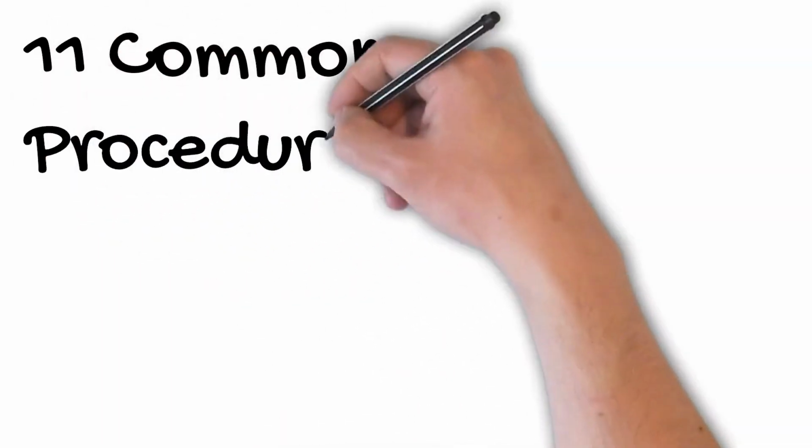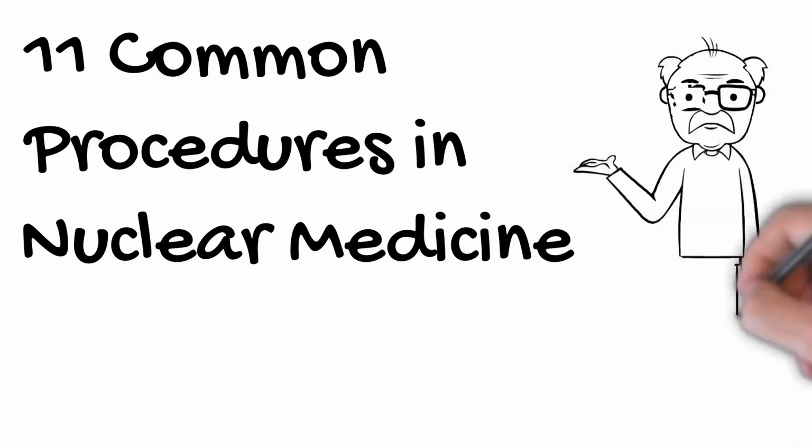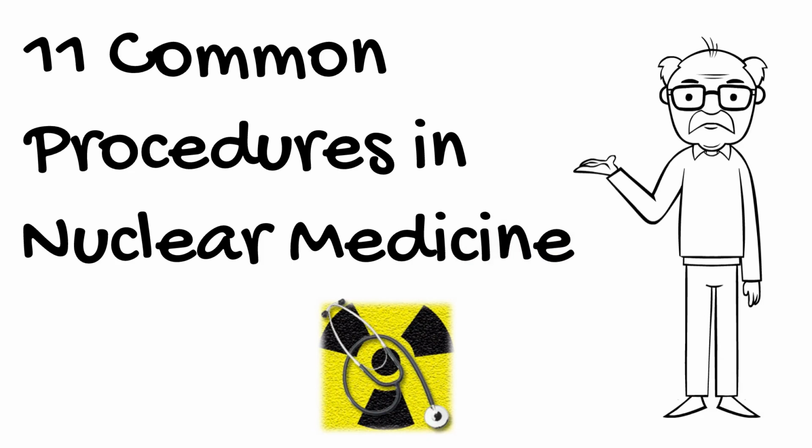If you've watched some of the other explainers in this series, you may be curious to see what kind of procedures are performed in nuclear medicine. Here's 11 common procedures performed in nuclear medicine.